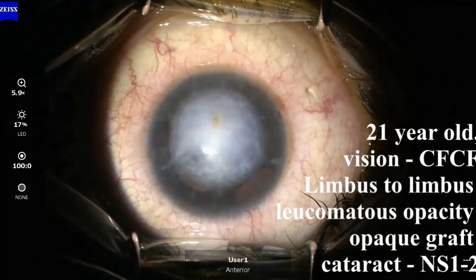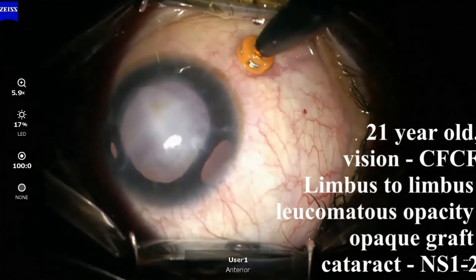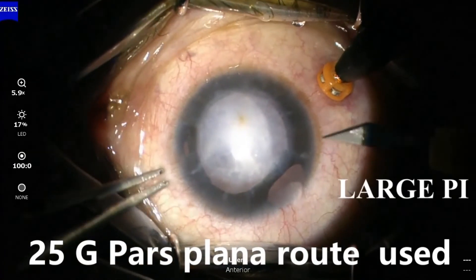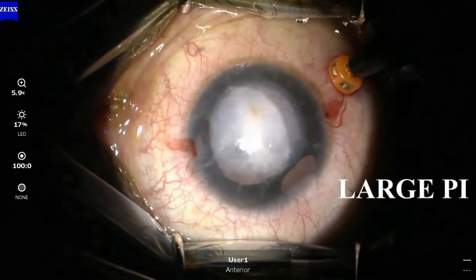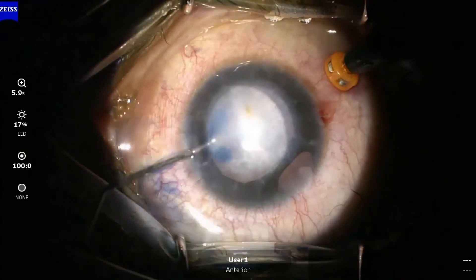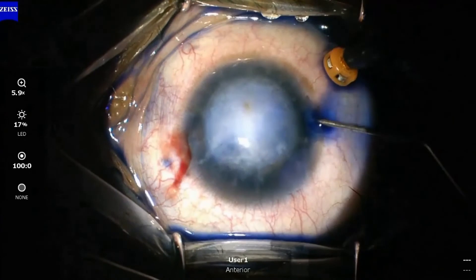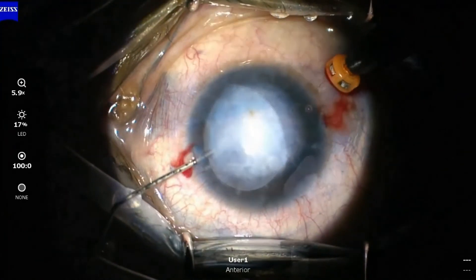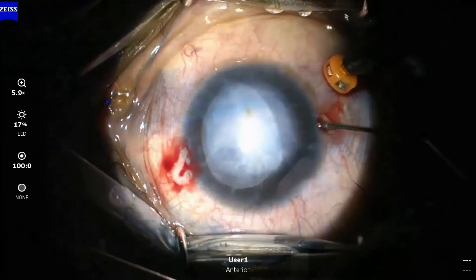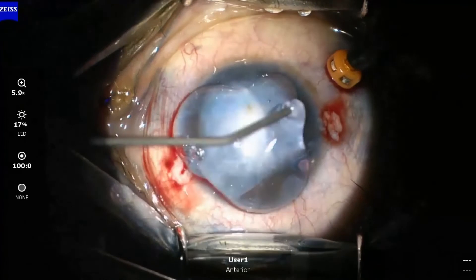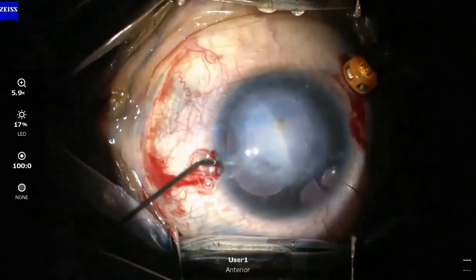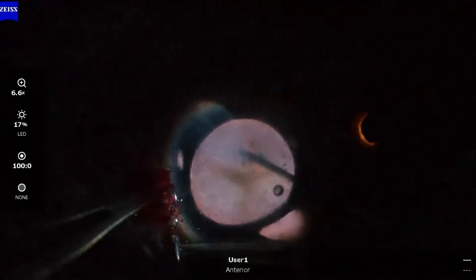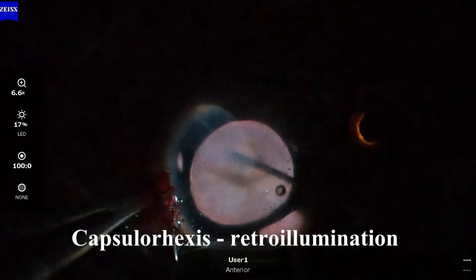The last case had an opacified failed graft with an early grade cataract. A 23-gauge chandelier illuminator was fixed in the inferotemporal quadrant. The anterior lens capsule was stained and endoilluminator-guided capsulorhexis was performed.